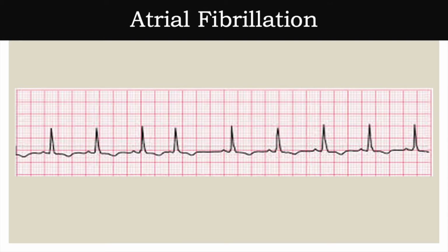So that's one thing that tells you the patient has Afib, because the R to R is not equal, and that usually only happens in Afib. So that could be a test question, because I believe I had one time. It was just describing the Afib, and it was just that the R to R intervals were uneven.